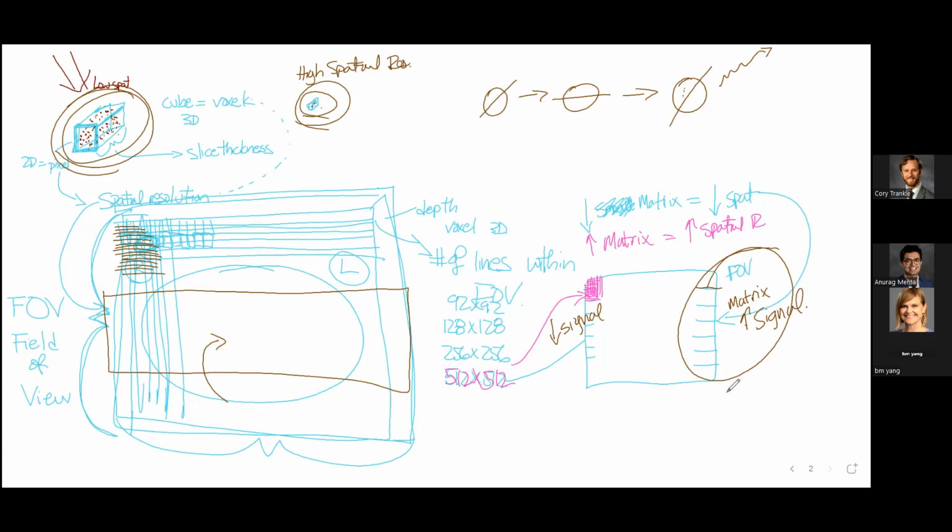That's T1. It could be an infiltrative process that gets in there. Amyloid protein gets in that interstitial space. That's going to drive those T1 values: if you're at 1.5T, to 1200; if you're at 3T, to 1450, okay? It's a good clue.